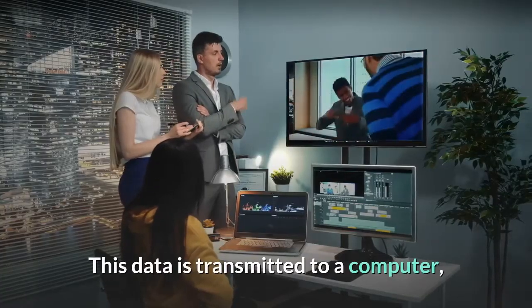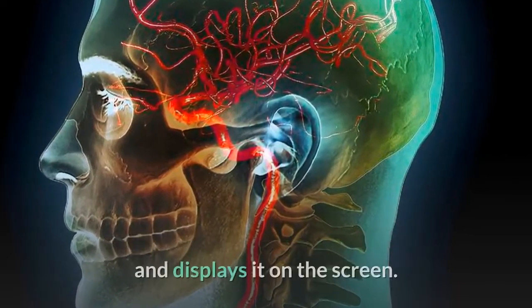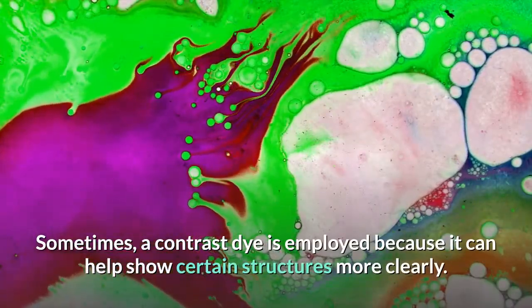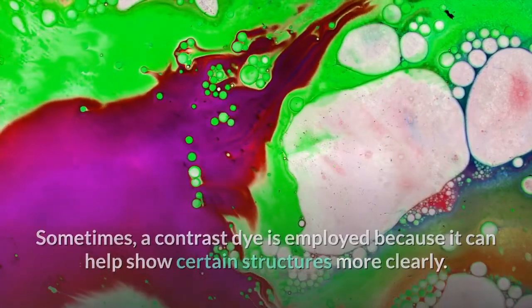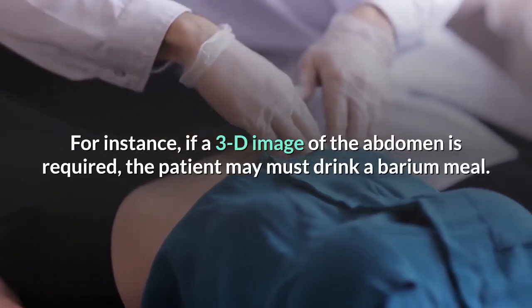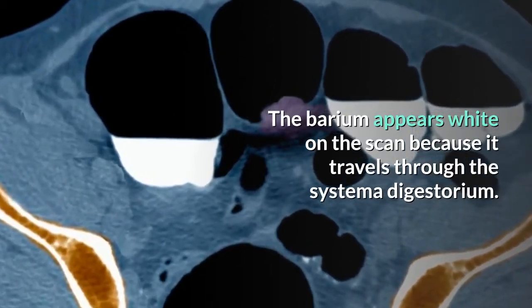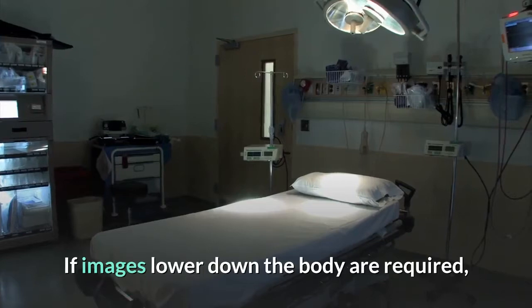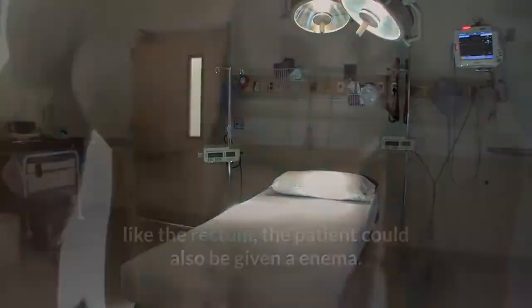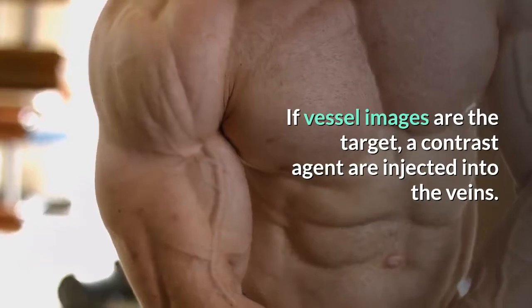This data is transmitted to a computer, which builds up a 3D cross-sectional picture of the part of the body and displays it on the screen. Sometimes, a contrast dye is employed because it can help show certain structures more clearly. For instance, if a 3D image of the abdomen is required, the patient must drink a barium meal. The barium appears white on the scan because it travels through the digestive system. If images lower down the body are required, like the rectum, the patient could also be given an enema. If vessel images are the target, a contrast agent is injected into the veins.